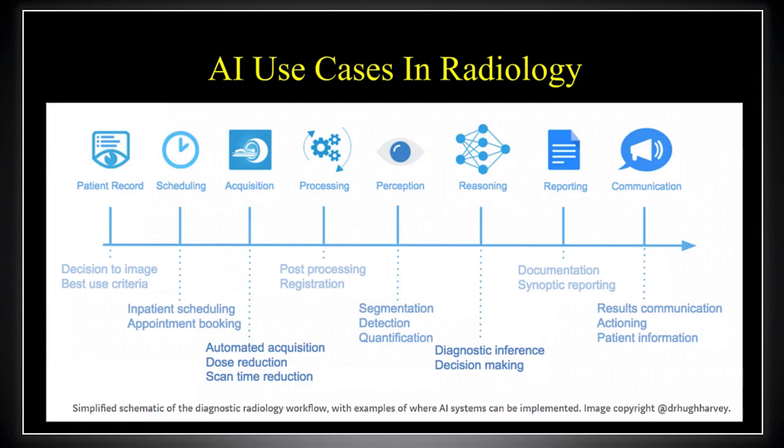As you know, artificial intelligence is already having an enormous impact throughout the imaging enterprise, everything from utilization management and clinical decision support, fueled by natural language processing and an ability to scrape the medical record, to things like scheduling. We did a very in-depth evaluation of a no-show project, and we found that there were multiple factors, frankly, too many for humans to look at, that contribute to no-shows and give us the opportunity to anticipate and devote attention to those things.